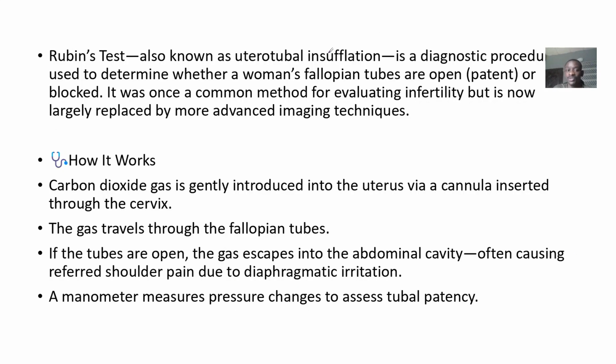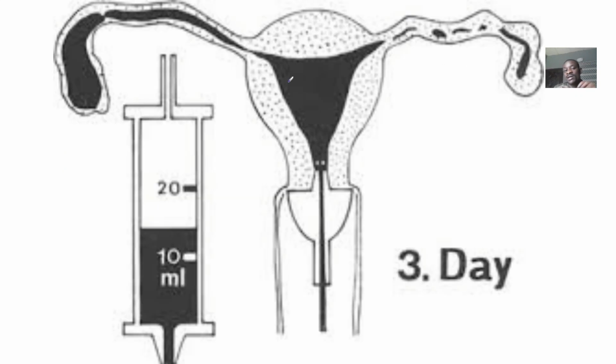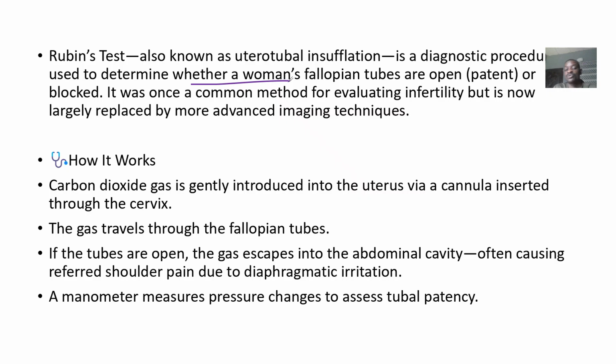So it's just a diagnostic procedure. It's used to determine whether a woman's fallopian tube is open. Do you understand? Because sometimes you can have some disease conditions that can block the fallopian tube. Do you understand? So you just want to confirm.